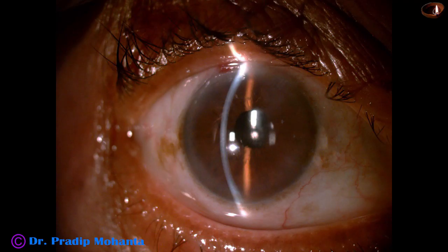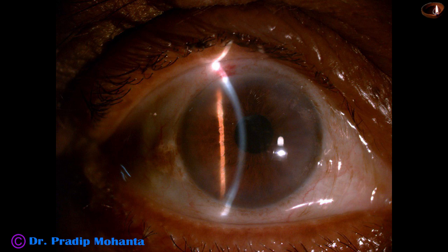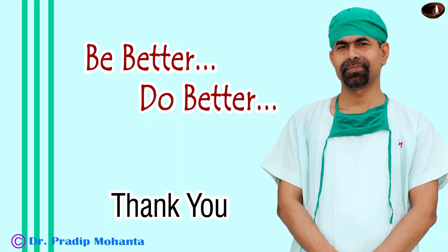Here are some post-op pictures. The cornea is clear, anterior chamber is deep and quiet, intraocular pressure is normal, and unaided vision is 6/12. The patient is very happy because they could not see with this eye for almost two years. Thank you very much for your attention. I hope this video will help you in developing your surgical skills. Be a great surgeon and serve your patients with love, respect, empathy, and great surgical skills. Learn to use a pupil expansion device when the pupil becomes small intraoperatively.